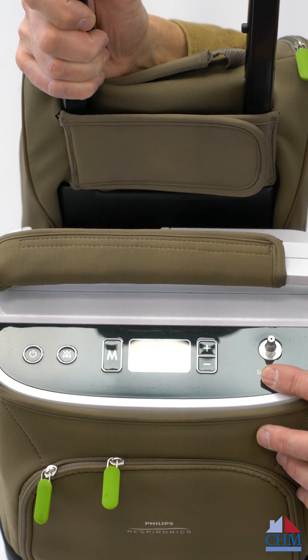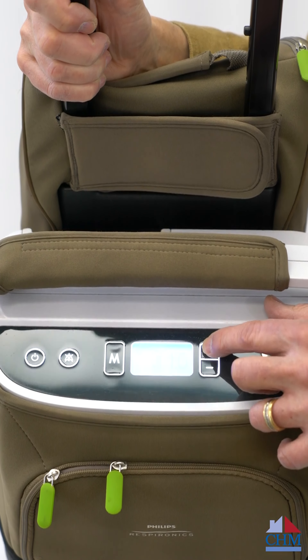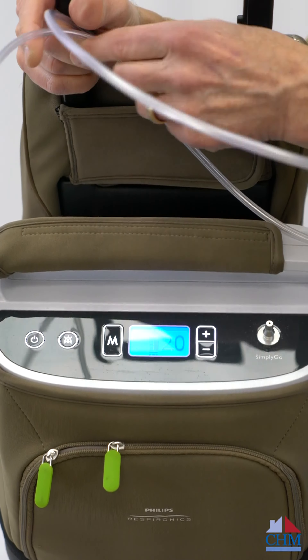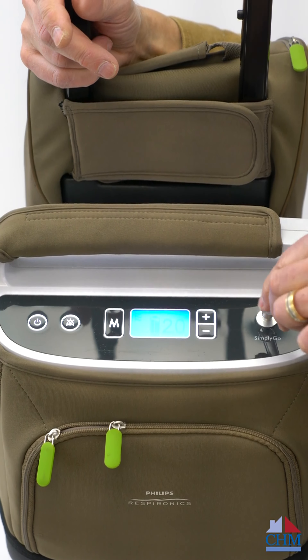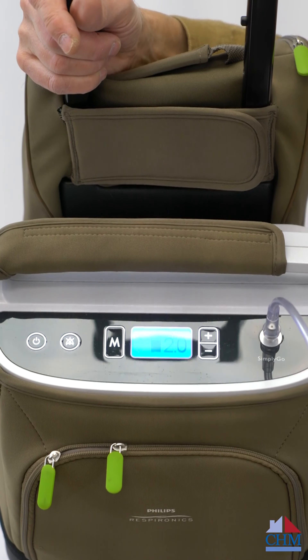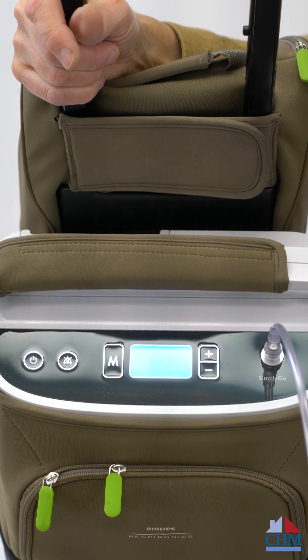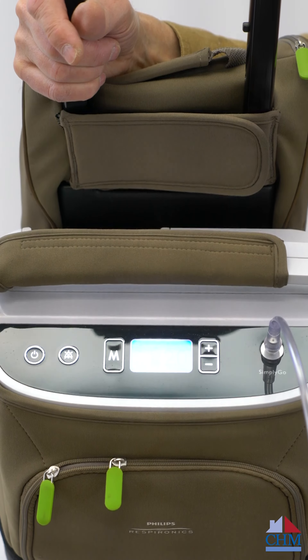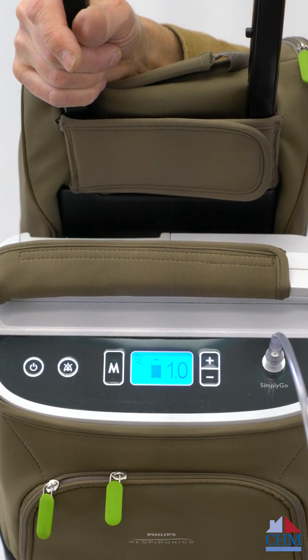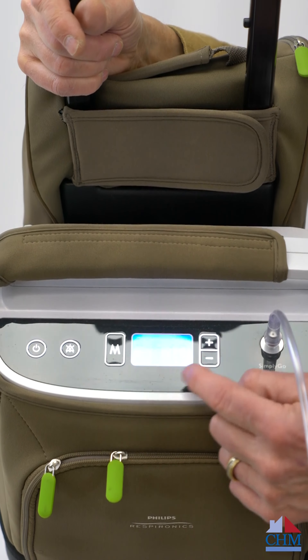The screen indicates what mode we're using and the charging status. The plus and minus buttons allow us to change the settings from 0.5 up to 2 in continuous mode. I'll attach a cannula to the oxygen outlet now. Looking at the mode indicator on the machine, there are wavy lines indicating the machine is in continuous flow mode — wavy lines mean continuous flow, measured in liters per minute. Currently it's set at one liter per minute. If I hit the mode selector, you'll notice this change.